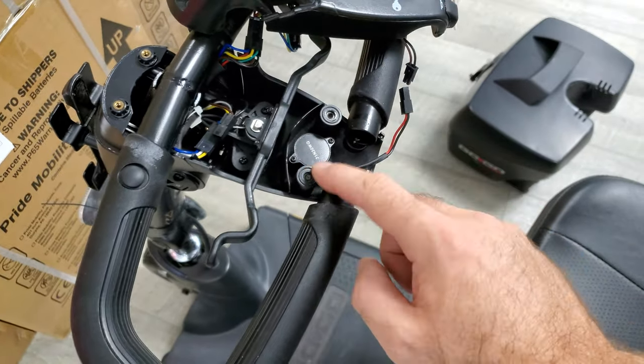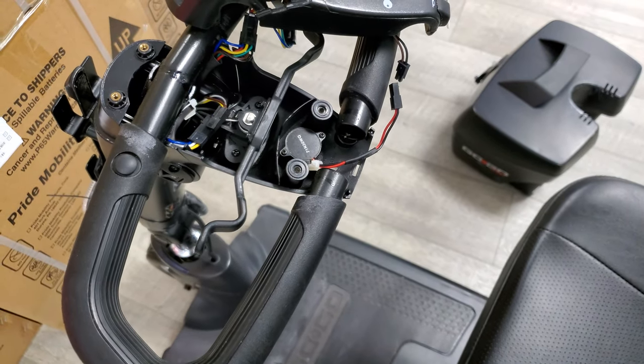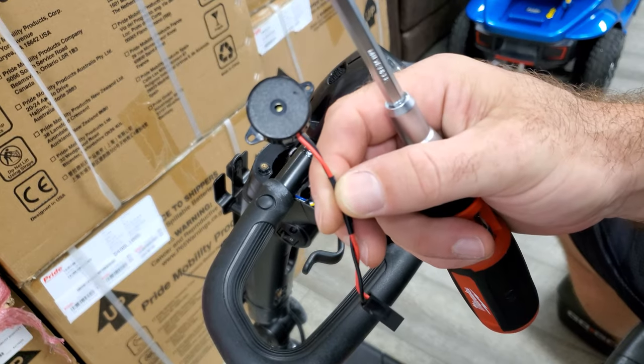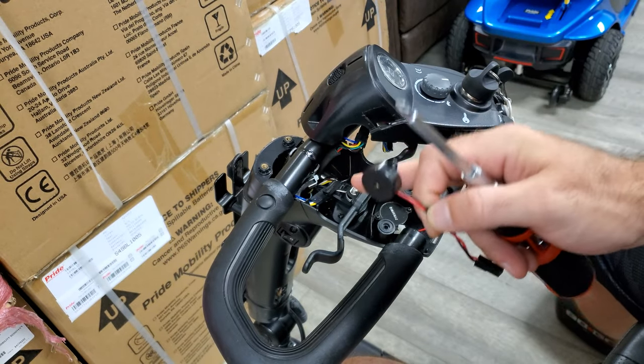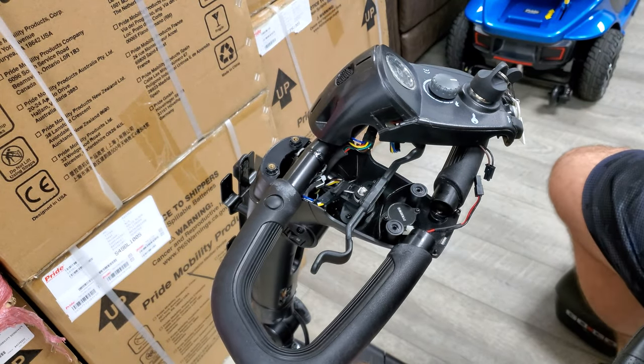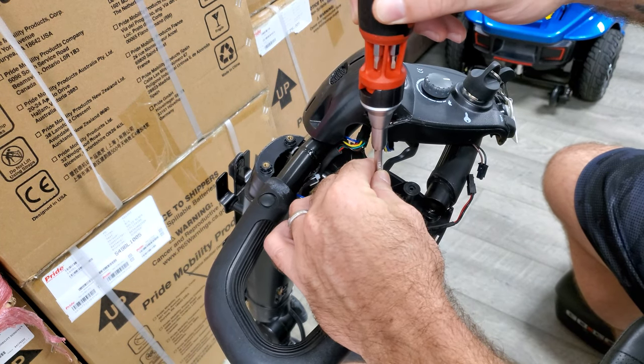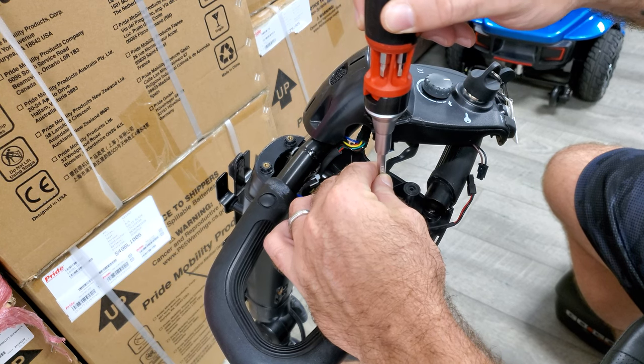There are two screws to remove this. What we're going to be replacing is essentially this part here. This is the working part — this one here does not work. Go ahead and remove the screws; looks like Phillips number three.